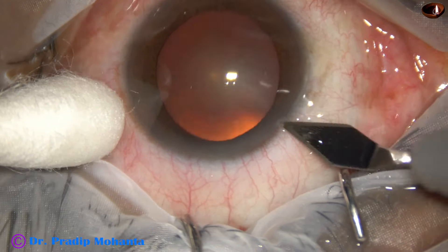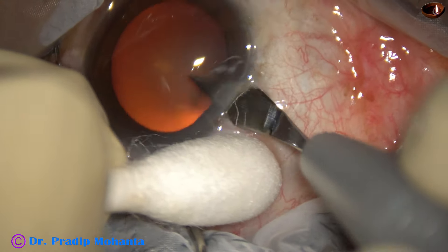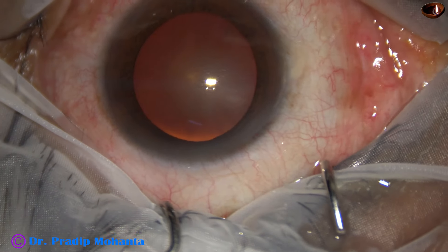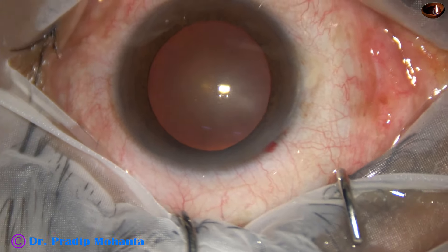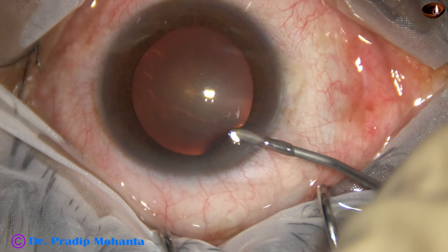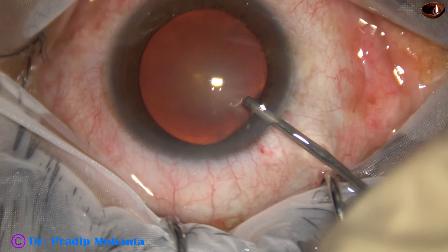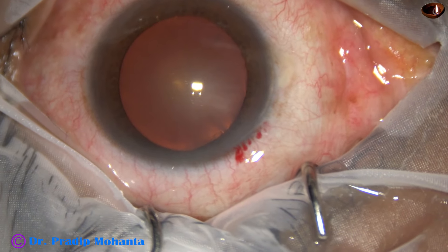This is the main incision with a 2.8 mm steel keratome at mid-limbus. And now the anterior chamber is filled up with 2% hydroxypropylmethylcellulose.